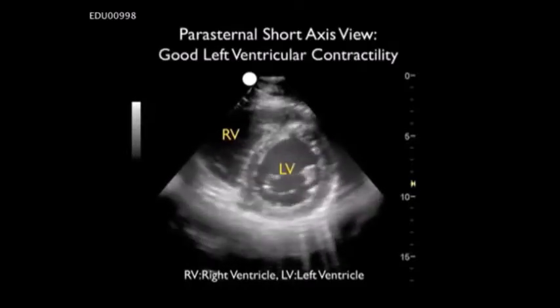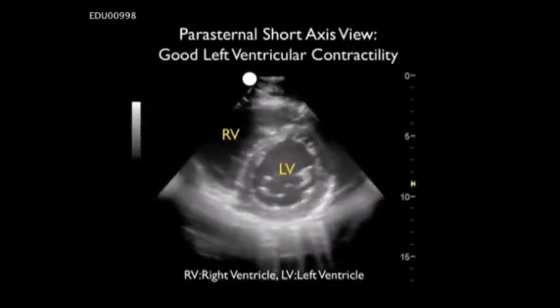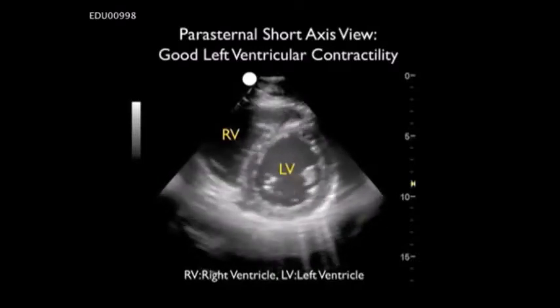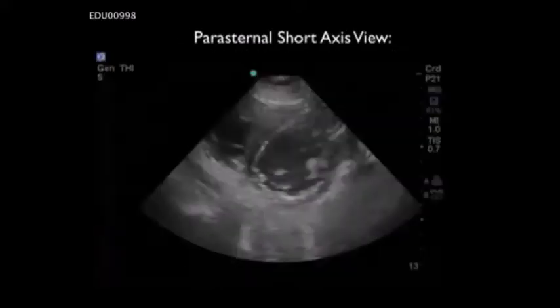So if this was a patient in shock, we can go ahead and give plenty of fluids before starting the patient on pressors. Next, let's take a look at another heart.